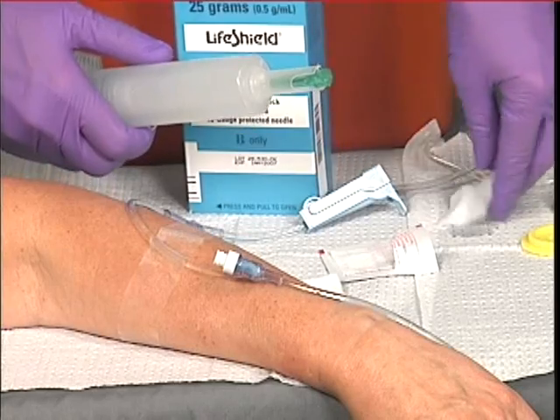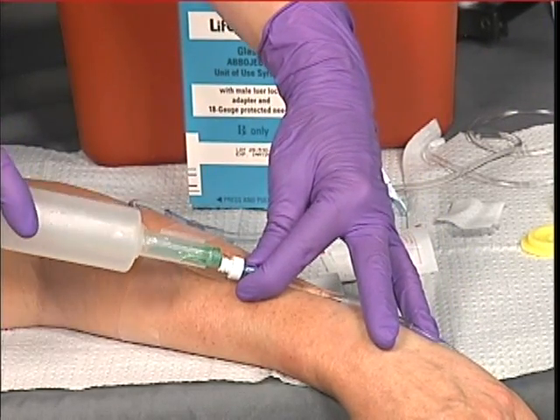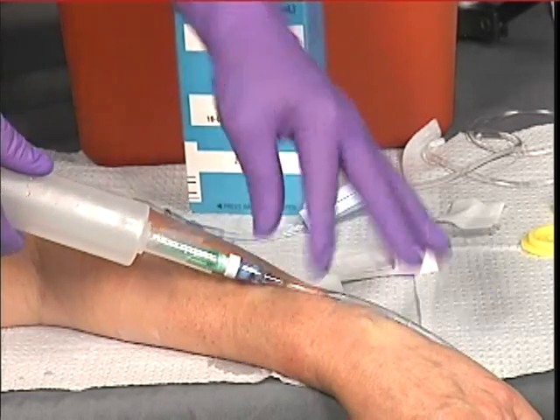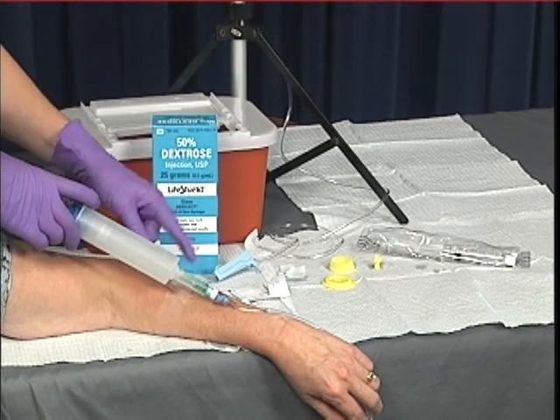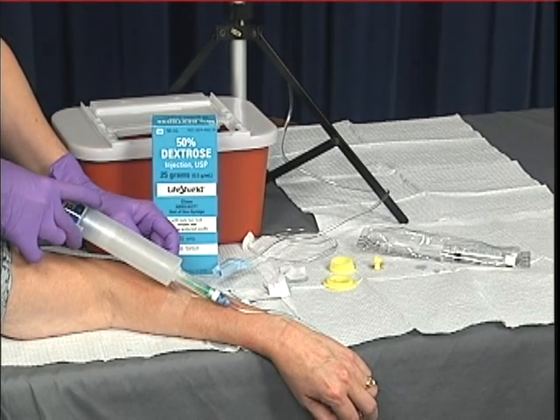Connect the syringe to the prepared med port by twisting clockwise for luer lock connections, inserting a blunt cannula for needleless ports, or inserting a needle through self-sealing ports. Kink off the tubing between the selected med port and the IV solution bag. Inject the medication at the proper rate.